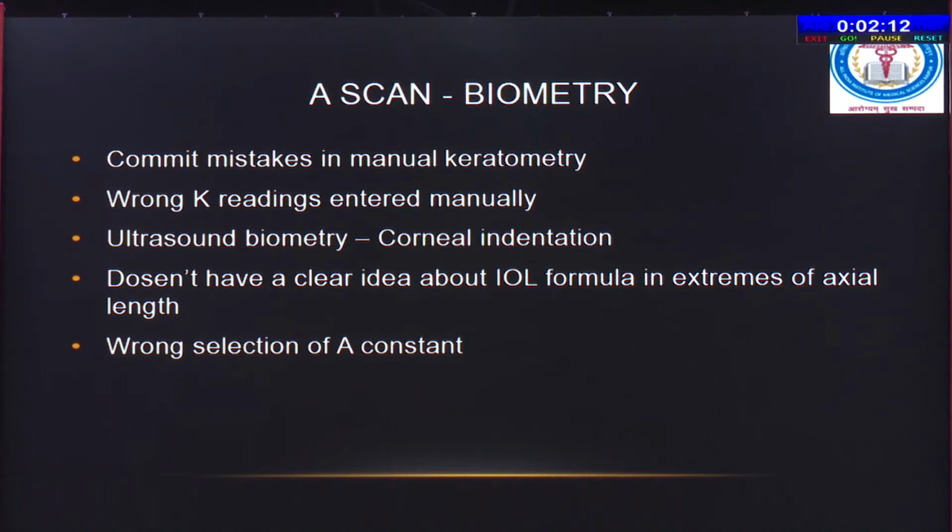The second important point is that in cases of contact biometry, if we do an immersion technique, it's good, but if you do a contact technique, then there's always a chance of excessive corneal compression out of hesitancy, out of not knowing the procedure, and of course it changes the axial length and the final IOL power. So this is the second important point which has to be kept in mind while the residents are doing it.